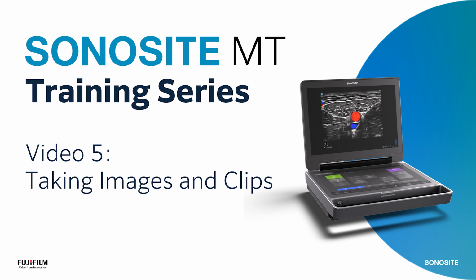Welcome to the how-to video, taking images and clips with Sonosite MT.